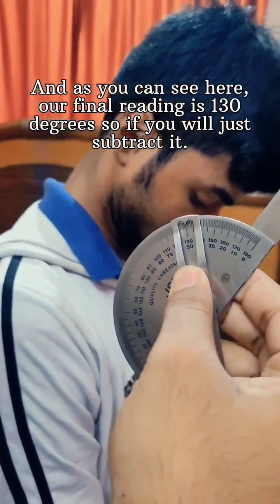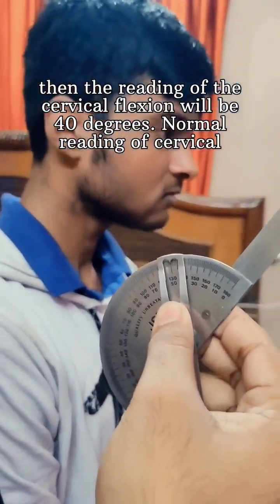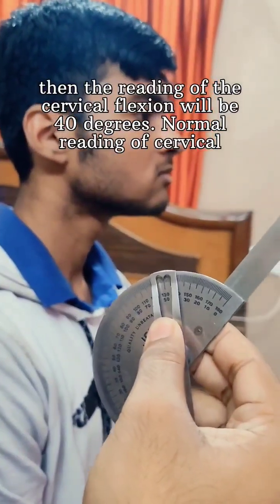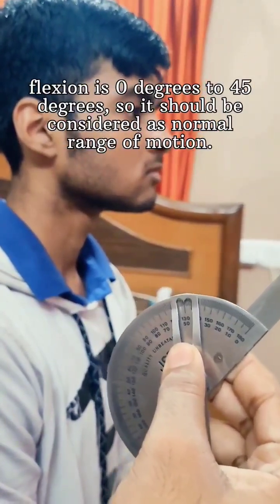If you subtract it, the reading of the cervical flexion will be 40 degrees. The normal reading of cervical flexion is 0 degrees to 45 degrees, so this should be considered as normal.